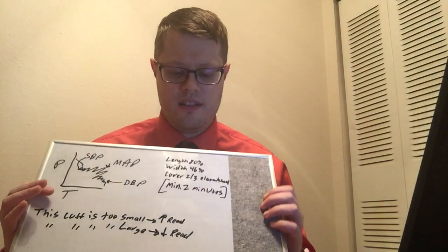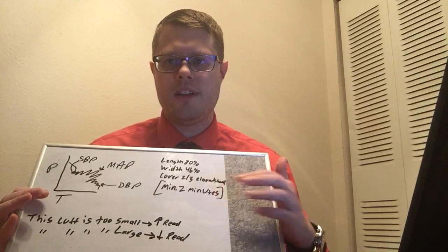As far as how we're measuring it, the important thing to remember is 2 minutes between measurements. You need at least 2 minutes. I'm sure many times in the ICU you took a blood pressure and then the doctor or nurse just had to hit it again and recycle. You're going to get venous congestion and you're wasting your time because it's going to be inaccurate. Results are less accurate with dysrhythmias.